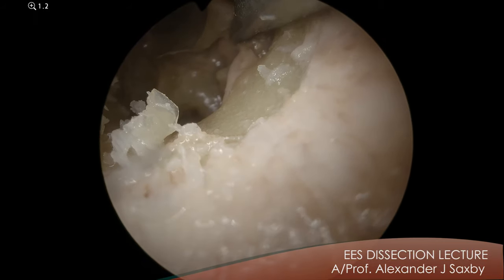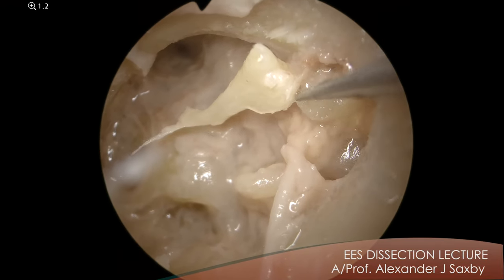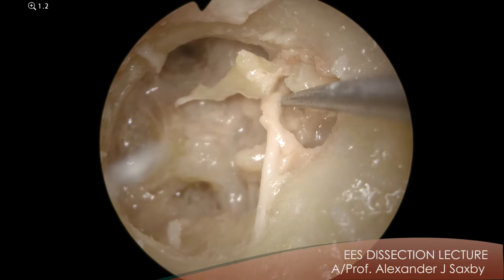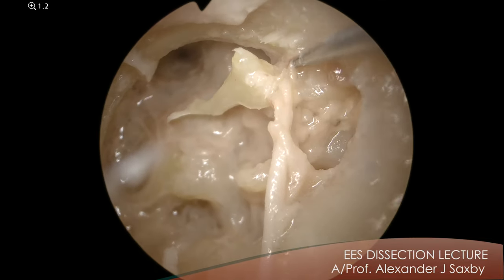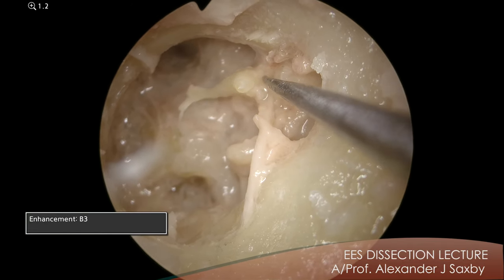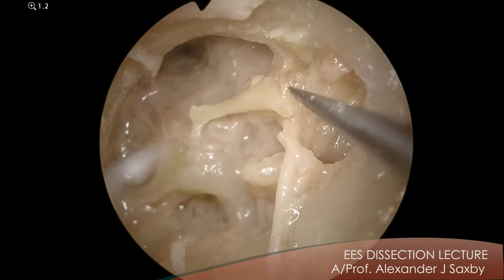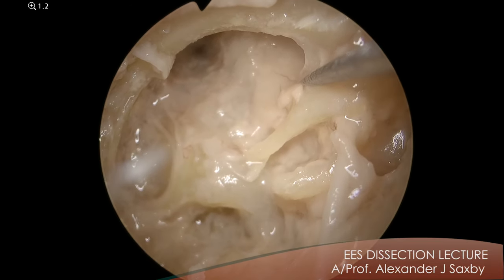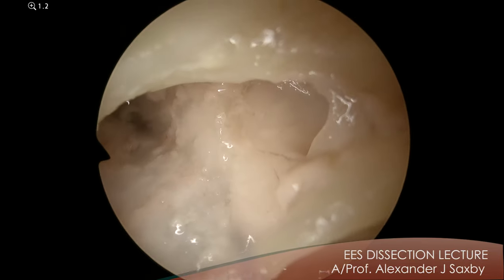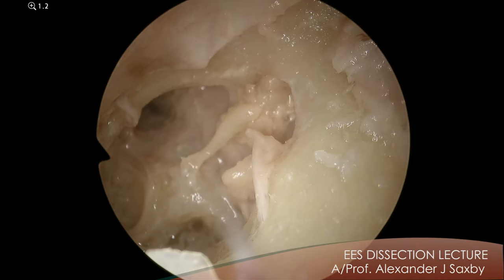So if we go under the neck here — can you see now that the chorda runs underneath the neck here. So here's the chorda nerve. It runs under the neck and exits through the petrotympanic fissure here with the anterior malleal ligament and the anterior tympanic artery. So the three things come out through the petrotympanic fissure just here. But the other really important thing heading anteriorly from here is the tensor fold. So if we turn to the side now we can look at that supratubal recess and the tensor fold heading forward from the tensor tendon.